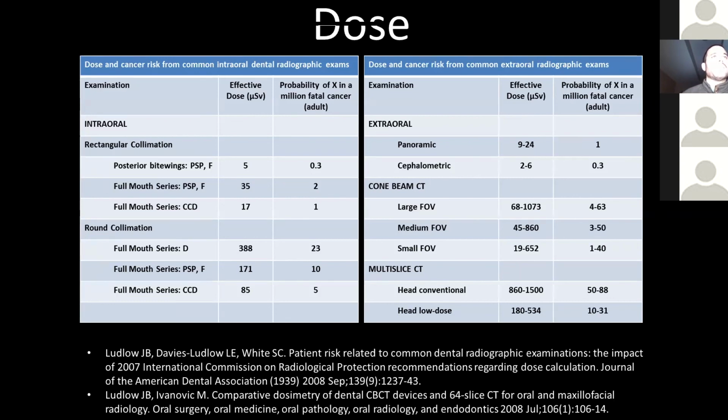For a young child that can't tolerate a bite wing x-ray, is it preferable to use a panoramic or a CBCT bite wing? Great question. I would go with the extraoral bite wing in that particular case, simply because it might be a little quicker than the cone beam CT.